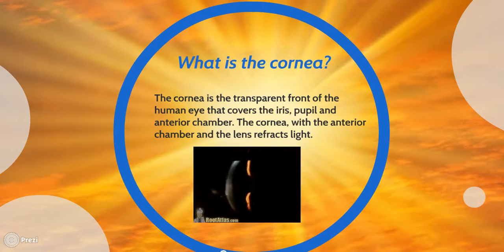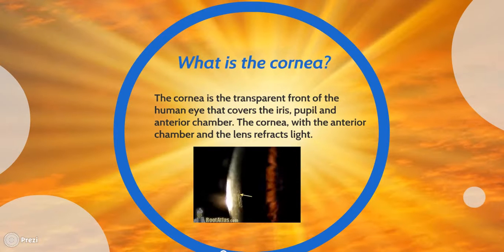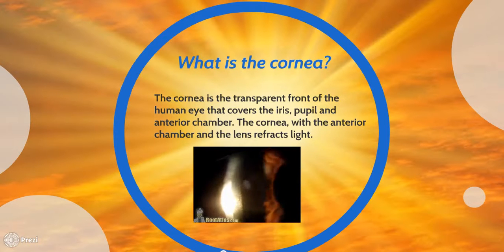What we have here is an ocular finding that is difficult for the beginning ophthalmology resident to see. On the back surface of this cornea are guttae or guttata, depending on your background, but these are little bumps on the back surface of the cornea. You can see them here.